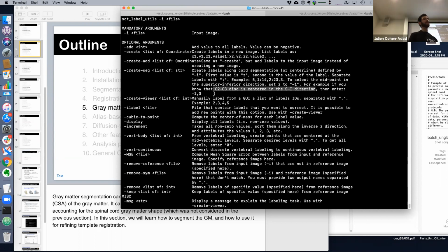Remember, I work on neonate data. Ah, yes, absolutely. And I've got problems also with segmentation because with DeepSeg I managed, and the viewer, but I realized later that it takes some TIFF. So I wanted some suggestions also because apart from the segmentation, there is also a problem on definition of ROI later. Because my aim is computing average diffusion metrics in white matter tracts. And yes, I have problems with the registration of the template.